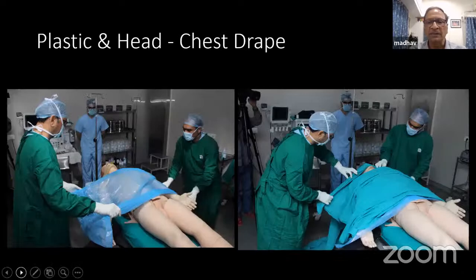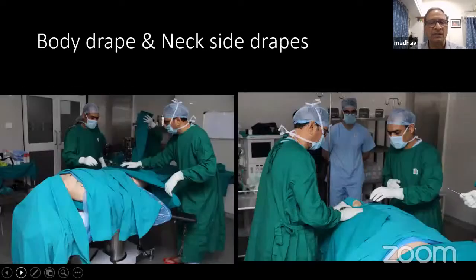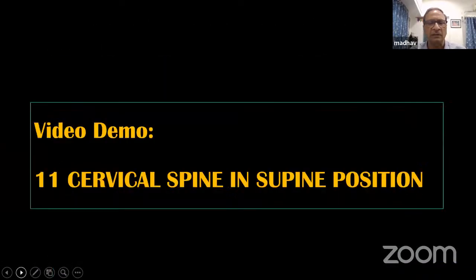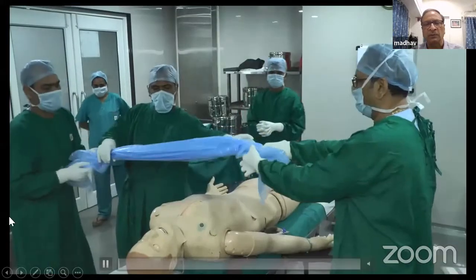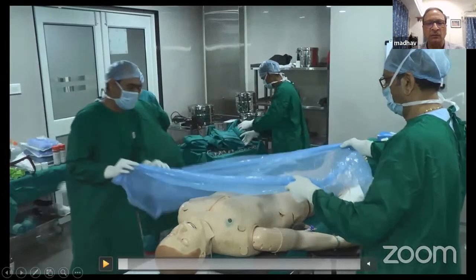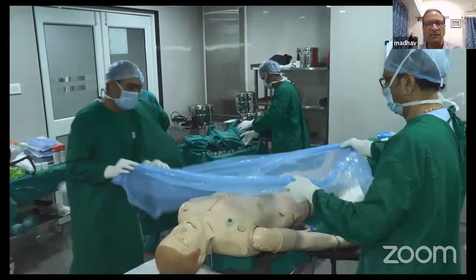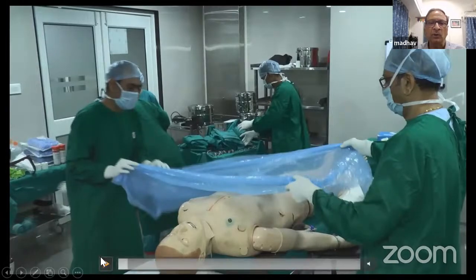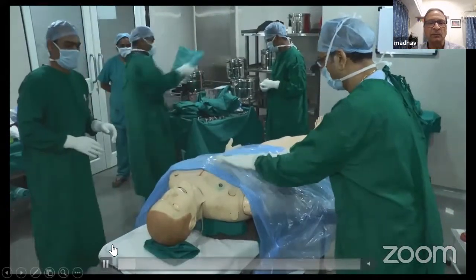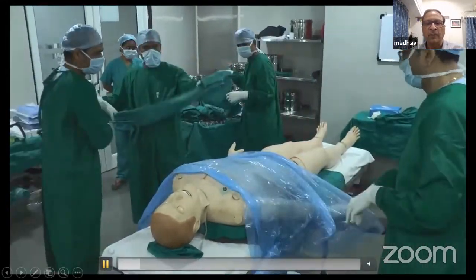Okay, so basically these are some of the slides. So you first take a plastic sheet, put it on the chest, covering the abdomen. Basically, it's not a very difficult thing to drape a cervical area because it's a very small area, the operating field is not very big. You put a large plastic sheet first, which goes from the clavicle below, covering the chest and the abdomen. That is the first sheet.